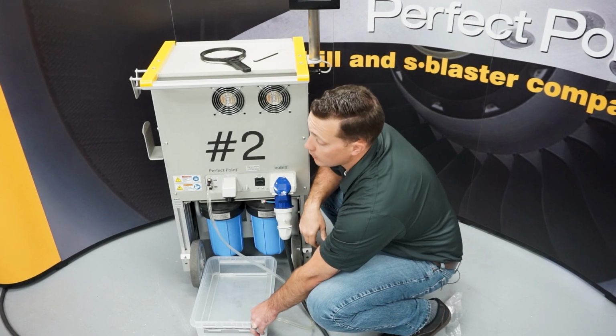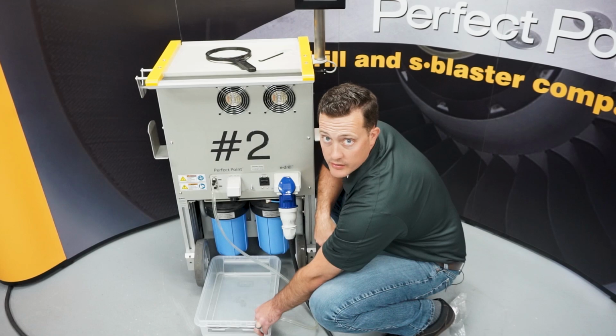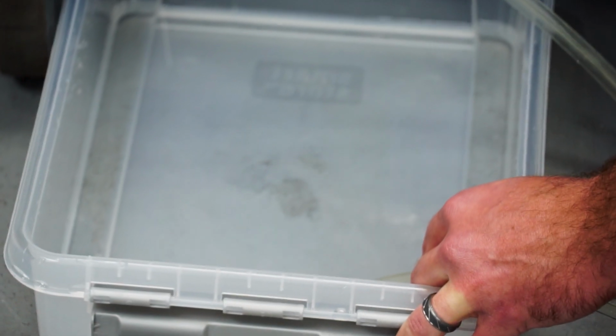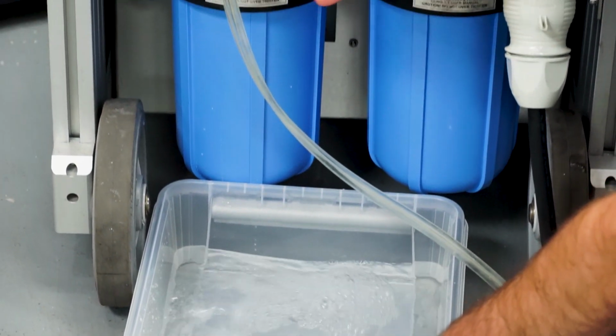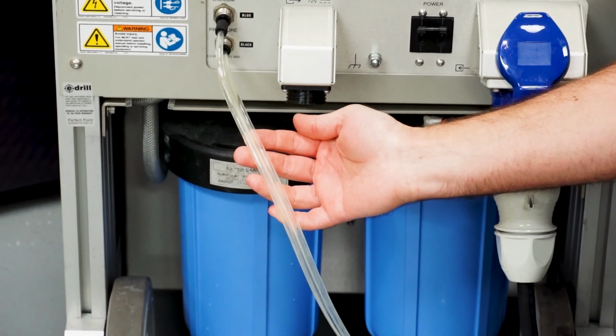Okay, so now that our tank's full, we're gonna let the hose sit in there for a couple seconds to make sure we're getting that really nice full volume of water inside the system. Then we're gonna hit empty sediment canister and let it purge itself. Again, we're looking in the pressure side of the tube to make sure there's no cloudiness, to see if there's any air in the system.